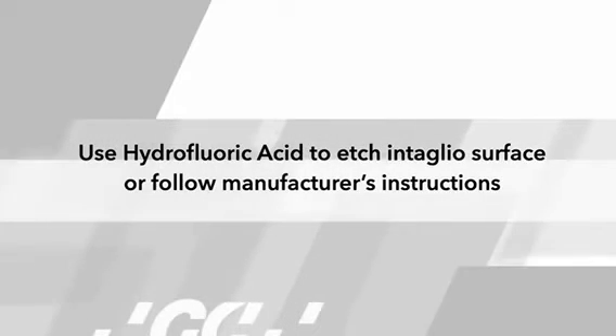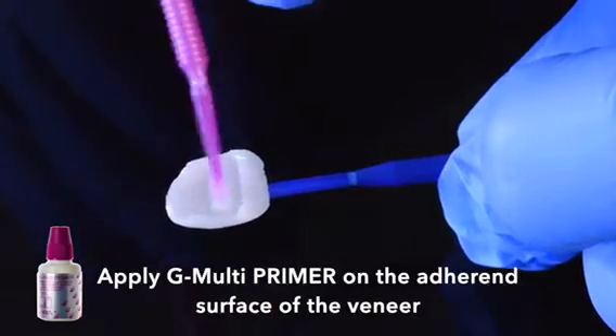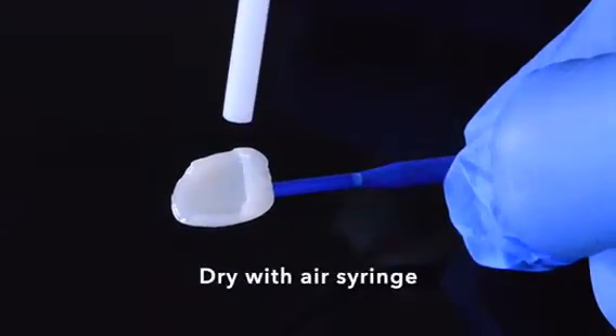Prepare each restoration according to manufacturer's instructions. Now, apply the G-Multi primer on the inner surface of the veneer and dry with an air syringe.